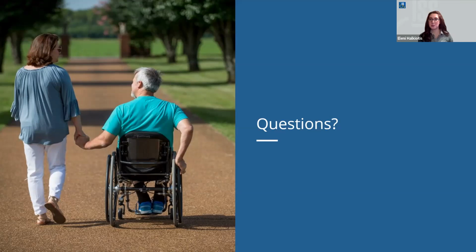Yeah, I'd also say, good is better, or better is good. Sometimes we have all these things that we want to be able to do with our client, and maybe they can only tolerate so much change with this new system. But we implement a few of those changes with this system, and then maybe the next chair, they are ready to do a lot more, or even the next year, they come back and they say, you know what, I'm sitting in the chair more, I'm ready, you can get more aggressive with this back, we can even switch the back out, things like that.